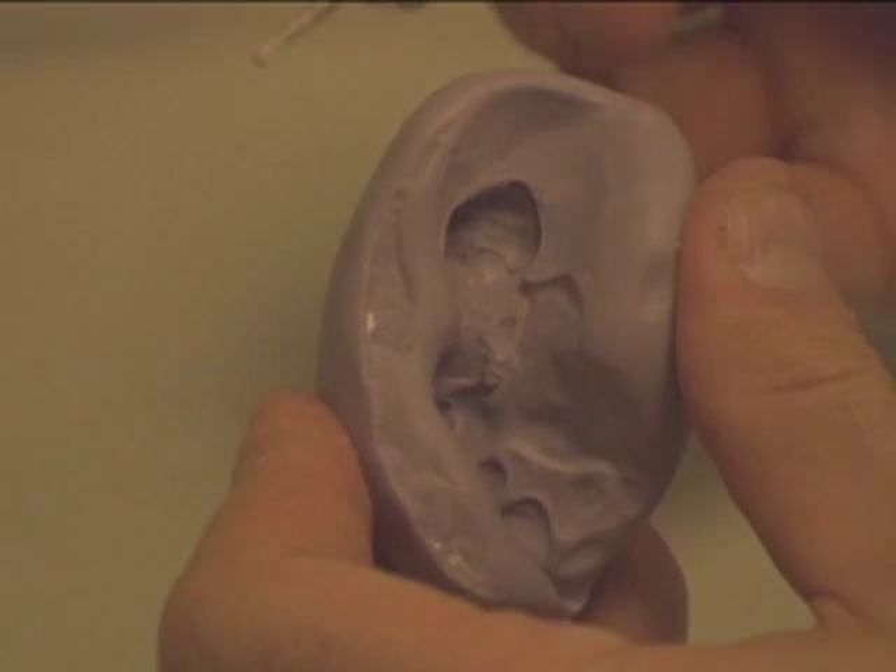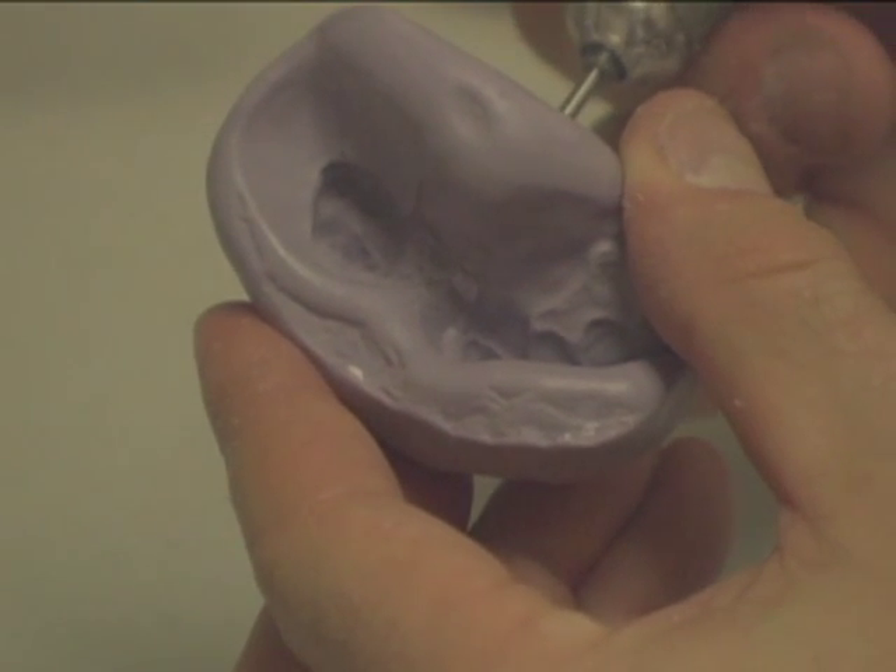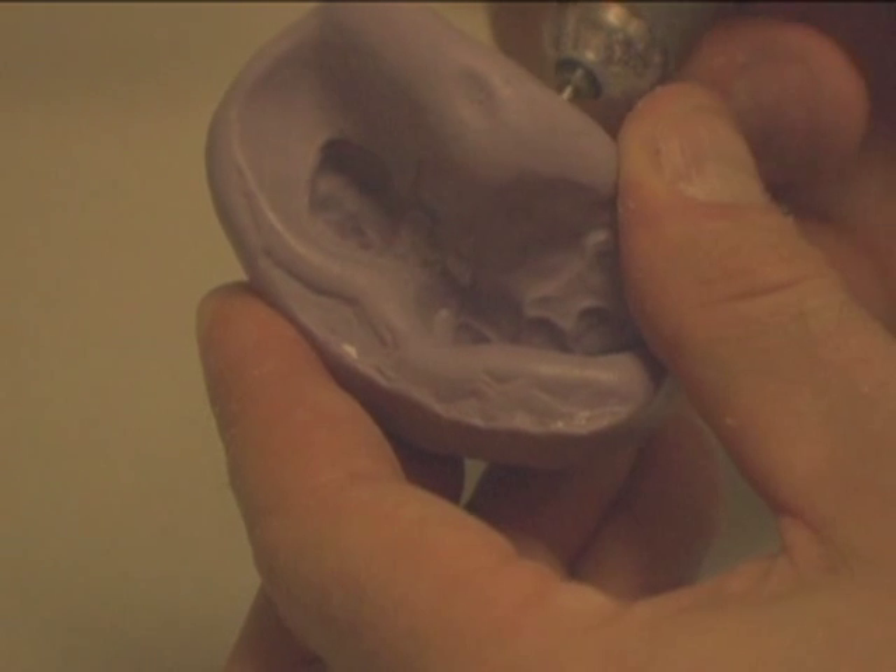Where the clasp joins the partial, drill a hole out through the putty coming out on the lingual side. This creates a vent hole.